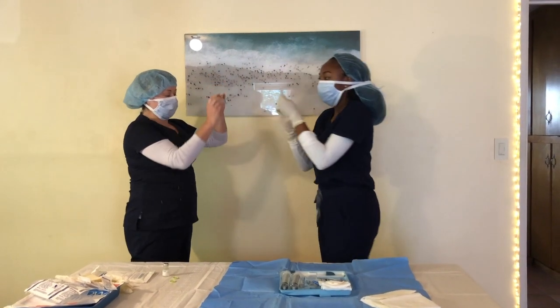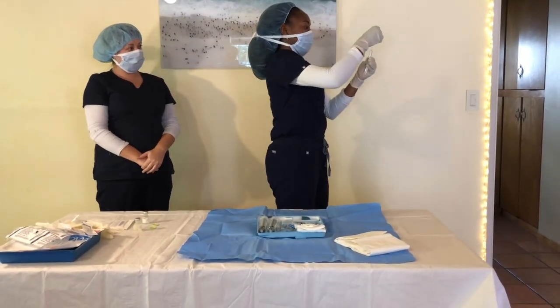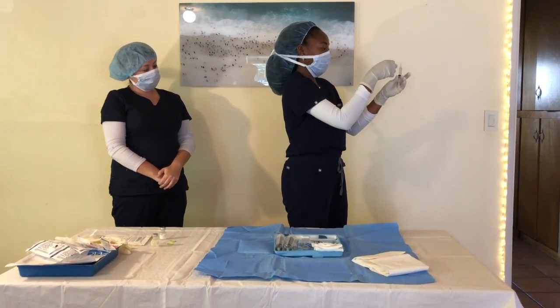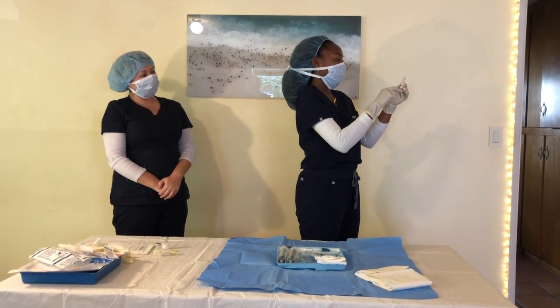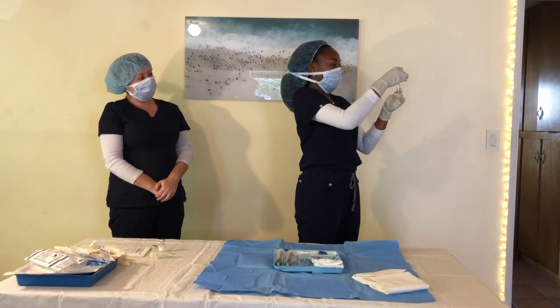Now I'm gonna pull out. Perfect, just like that. I've got this. We're gonna take the air out first. See, I'm now doing this not over the sterile field. I learned my lesson from earlier. And I'm firmly flicking this. And all my air bubbles are going up, actually. And then sometimes you have to do that. Perfect. Still have 4 cc's. We're gonna cap this.